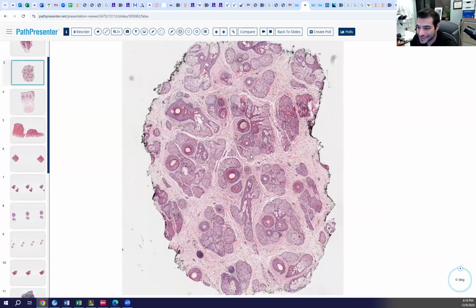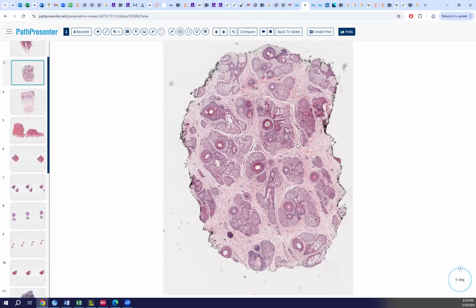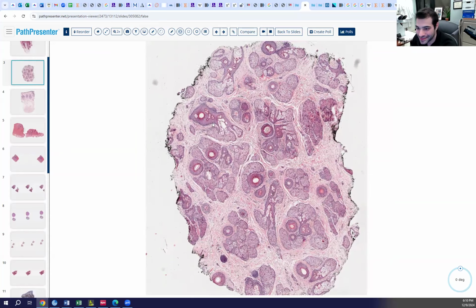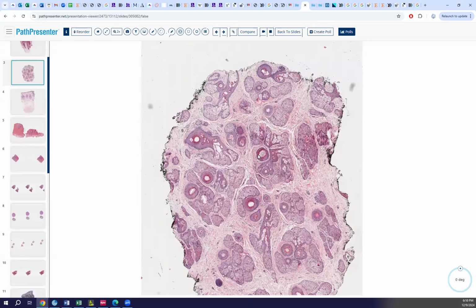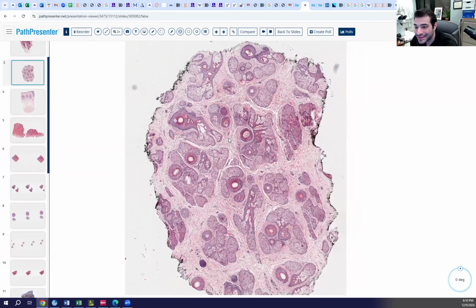All right. What's different about this type of section? This is a transverse section, coming at you along the z-axis. So how do we approach these? Well, the first thing is, what level are you at?